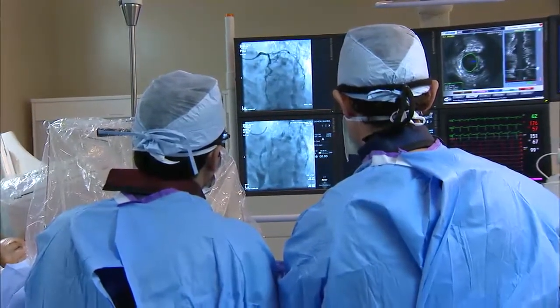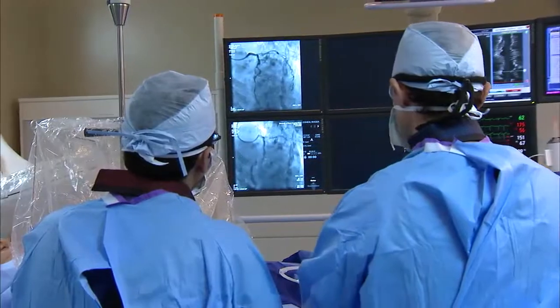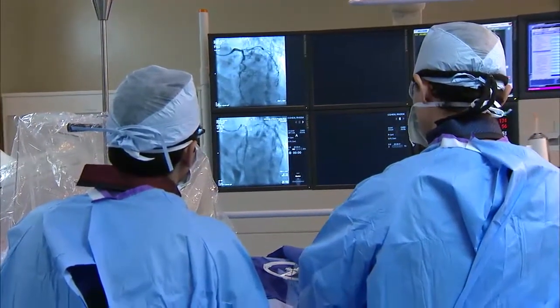At certain times, you may be asked to hold your breath for a few seconds, allowing the X-ray image to be taken. Your doctor will inject dye into your right coronary artery opening, known as an ostium, as well as your left coronary artery ostium.